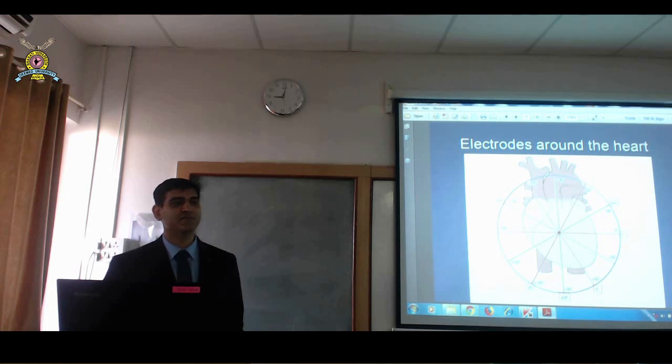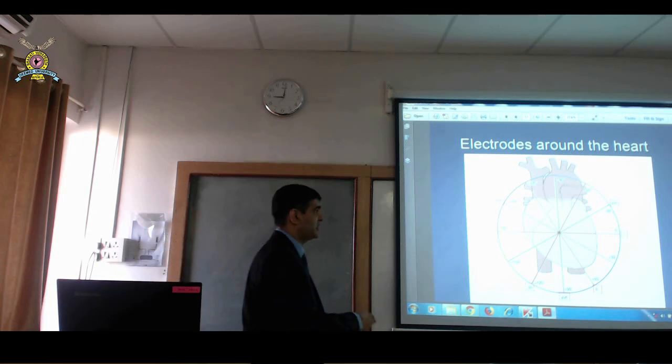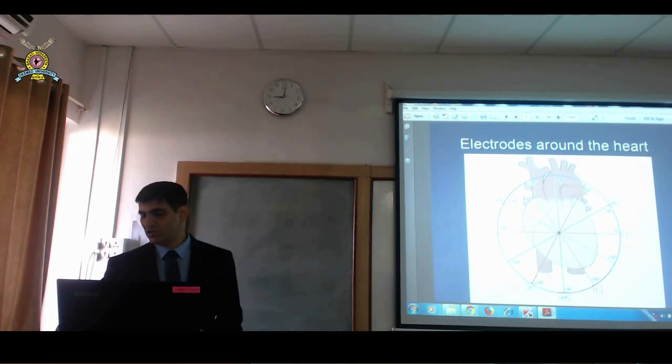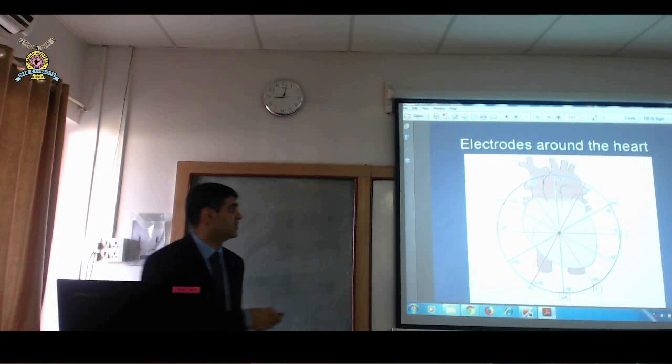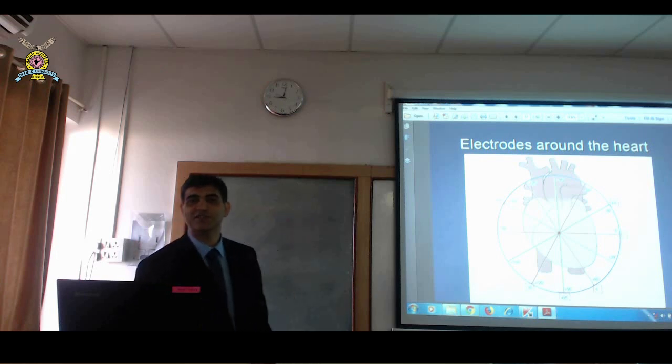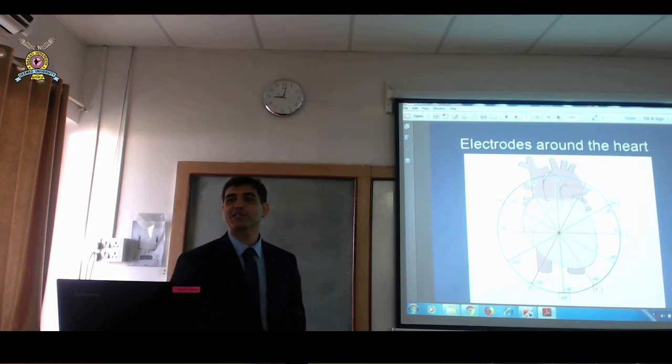You've done axis, right? Left axis, right axis, right? Everything of that division of axis is based on this image. This is one of the most important images you have to remember. Why I stopped here is because you have to remember that this is the image which will give you an idea about the axis. Okay, is anyone interested in axis? Do you look at axis when you see an ECG or you don't bother?